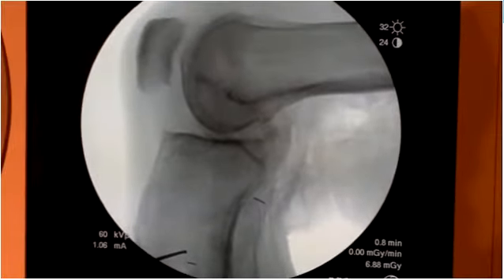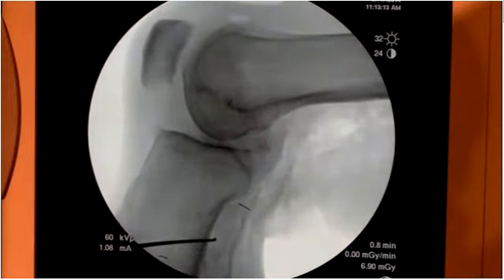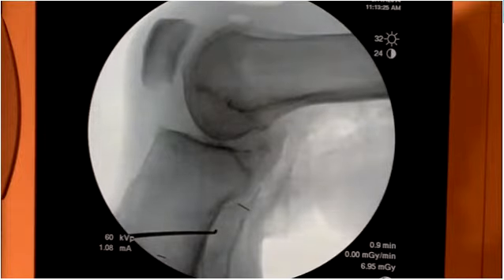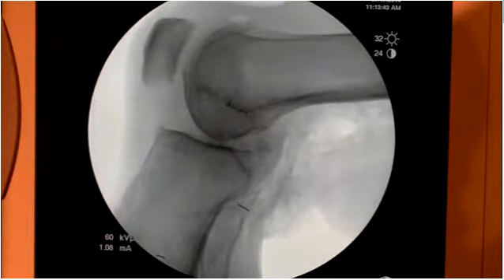Okay. So those are the key structures on the medial side. I've also dissected out the lateral side, and I can show you the fibula attachment of the LCL. I actually have the ligament dissected out, and there is the attachment site. Right there, okay? And then on the femur, similarly, I've dissected out the ligament, and I think it's here. X-ray? Okay. Any questions on that?